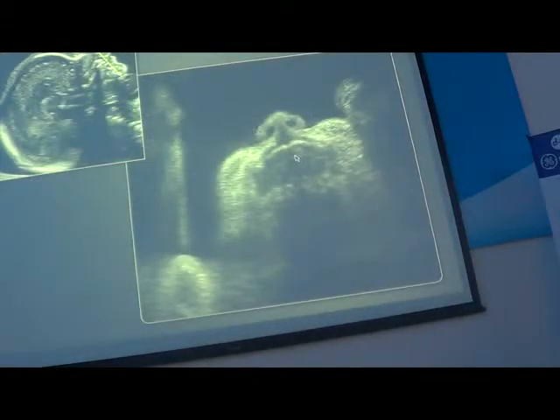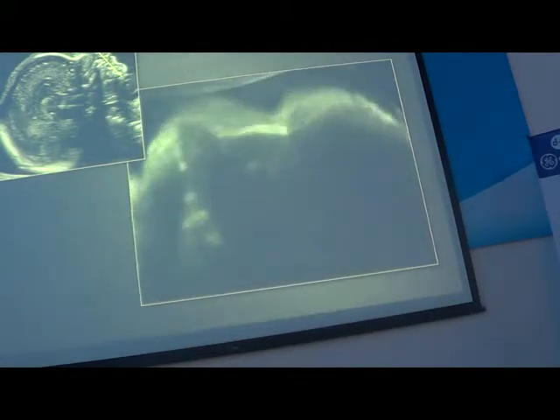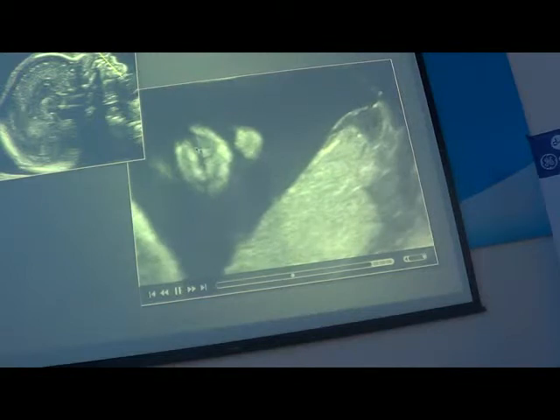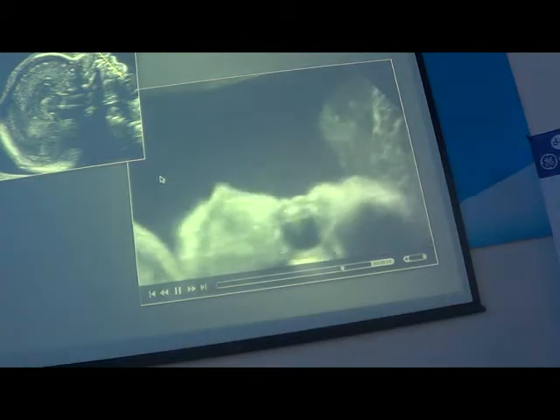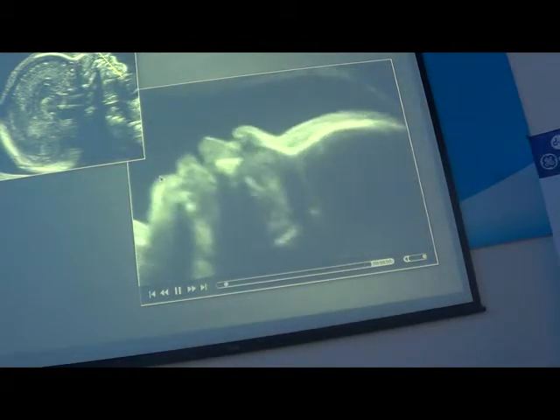The nose, nostrils. Đây là mũi và lỗ mũi. How to do it? You start with a profile view, you turn the probe, and you can clearly see the nose, nostrils, the lips, the chin. Làm thế nào để đạt được lát cắt này thì các bạn bắt đầu với cả đường kính ngang của mặt, bạn quay đầu dò nghiêng 90 độ, các bạn sẽ thấy được.